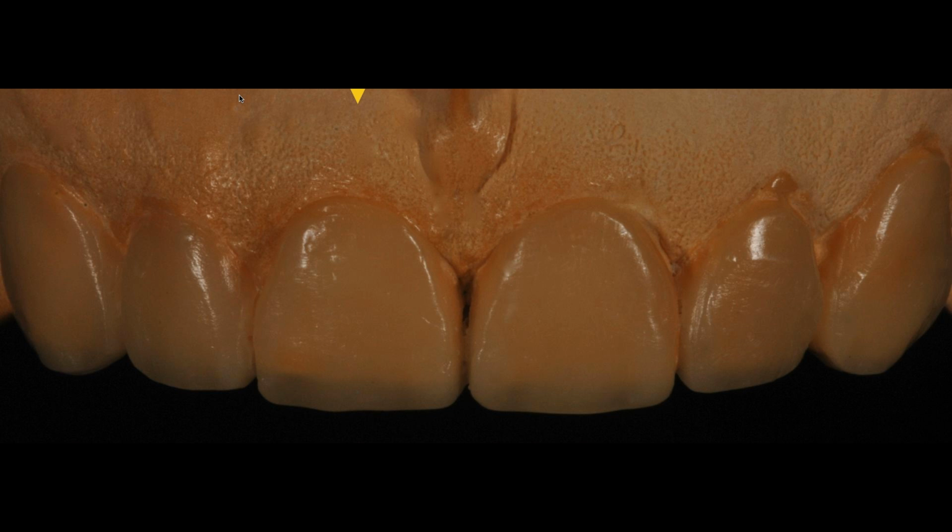But on that same day the patient came to our office, we took an alginate impression. Now we have the full photos. We have a full face photo with smile, we have a frontal photo, we have a lateral photo, we have the closer smile photo, then the intraoral photos, and then we do the segmental photos as well. And I'll show you all the photos that we use.